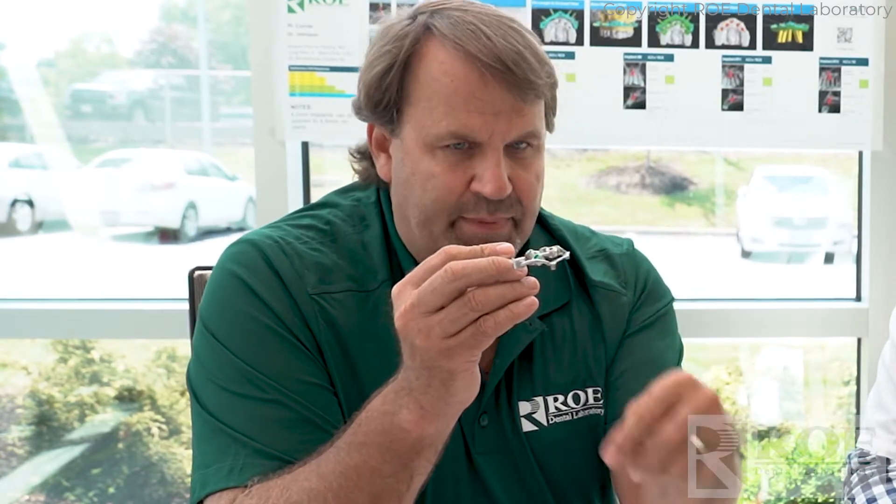As we said in the previous module, place your implants just below the osteotomy guide. Now if you're confident and you've done multiples of these, you can time it in this osteotomy guide. There are actually little nubs on there that with every system will tell you the timing of the implant and the 17 or 30 degree multi-unit abutment that will go on there.